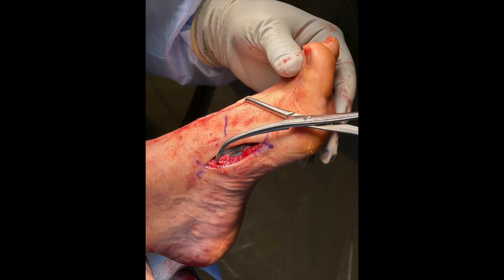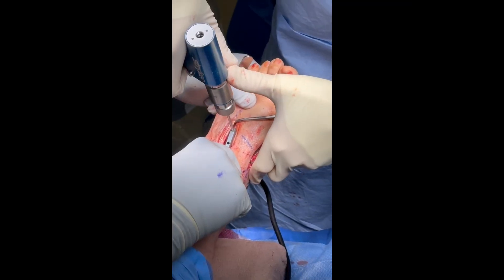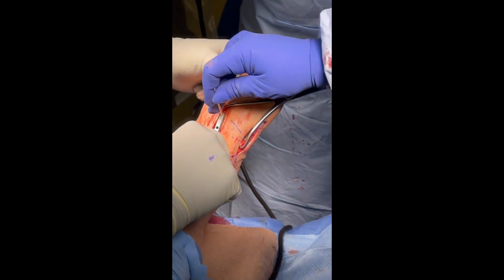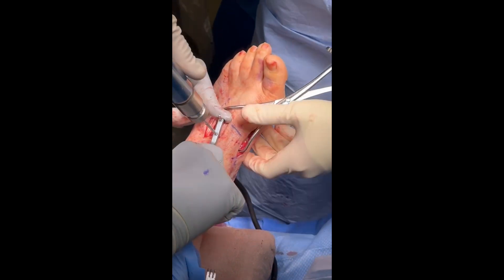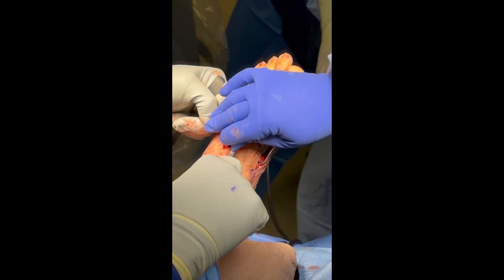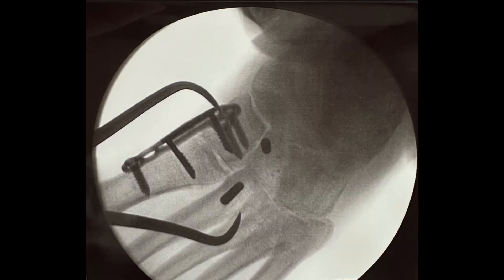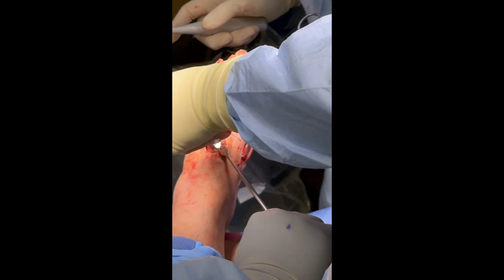A large pointed reduction clamp is then applied to reduce the second TMT and Lisfranc joint, which is confirmed on fluoroscopy. Utilizing the guide, we drill and place the first peg in the metatarsal base. The joint was further manually compressed before drilling for the second leg of the staple in the middle cuneiform. With pegs in place, fluoroscopy can be used to confirm positioning prior to inserting the staple, which is manually inserted and impacted into place.